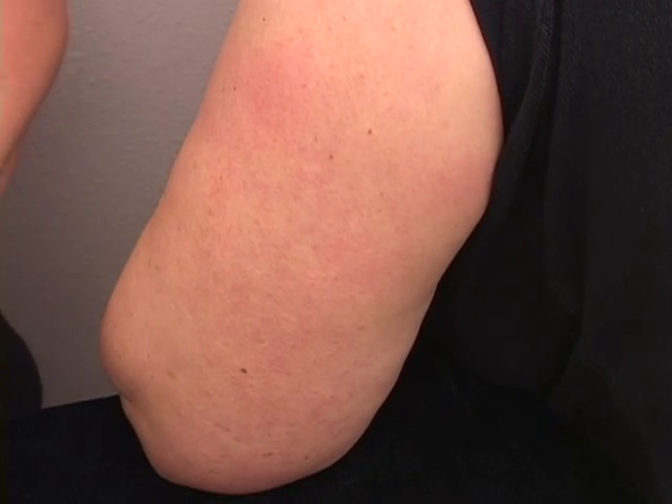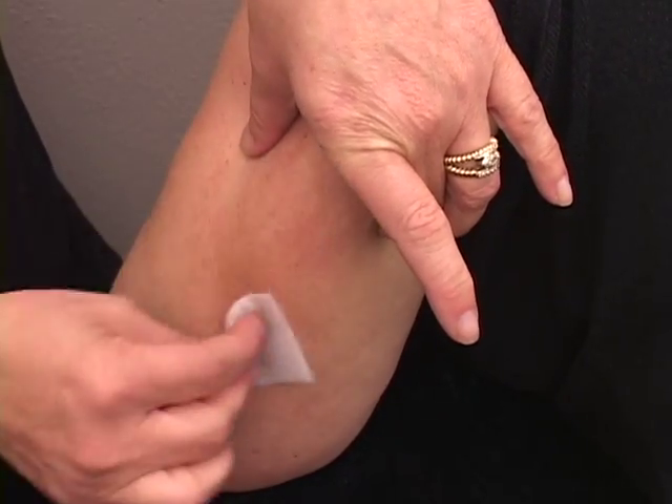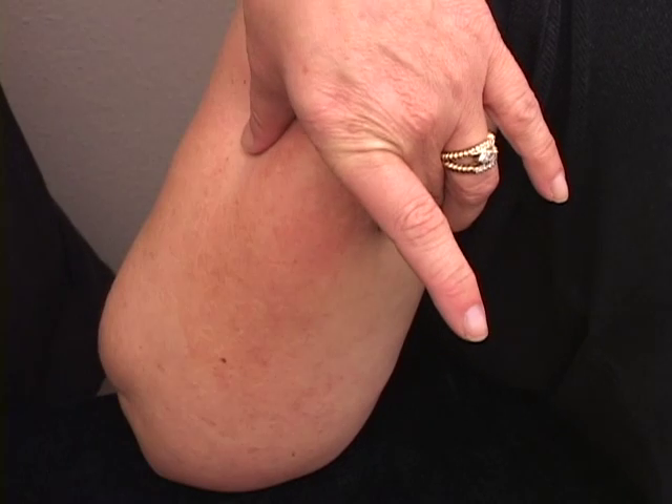Now you can prepare your injection site by cleaning it with alcohol. Pinch the tissue and scrub with your alcohol.